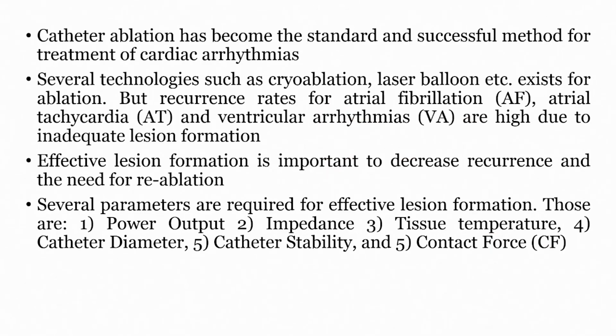Now, catheter ablation has become the standard and successful method for treatment of cardiac arrhythmias. It is already used in treating cardiac arrhythmias. Several technologies such as cryoablation, laser balloon, etc. exist for ablation, but the recurrence rates for atrial fibrillation, atrial tachycardia and ventricular arrhythmias are high due to inadequate lesion formation.